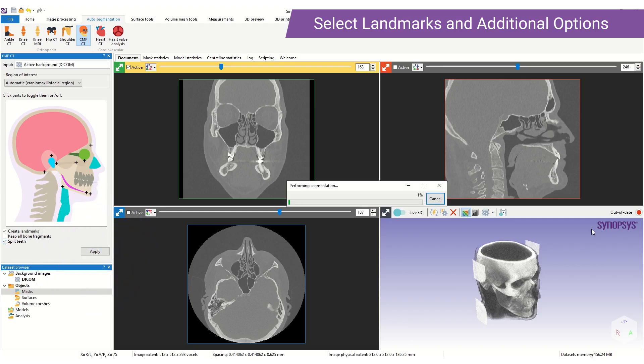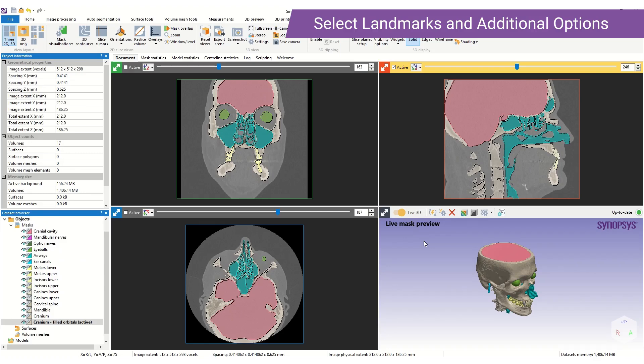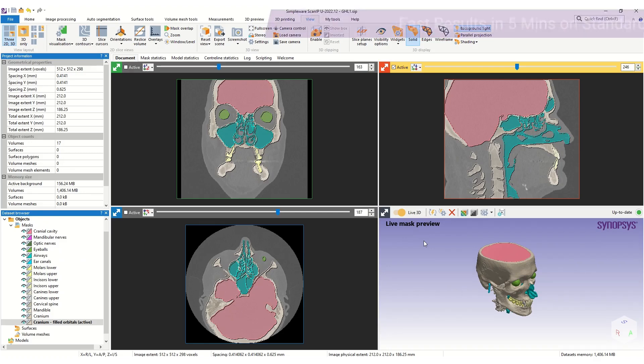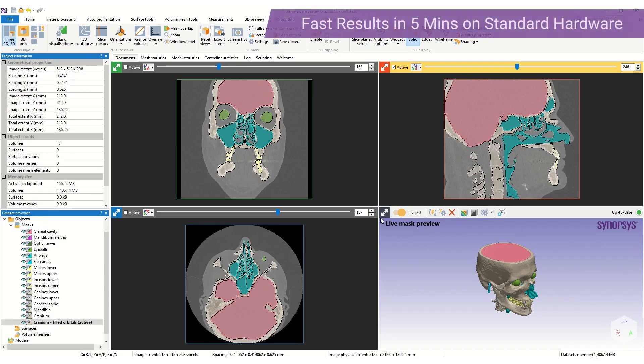To run the tool we click Apply and we wait for the tool to run. The tool takes approximately 5 minutes to run on standard hardware.